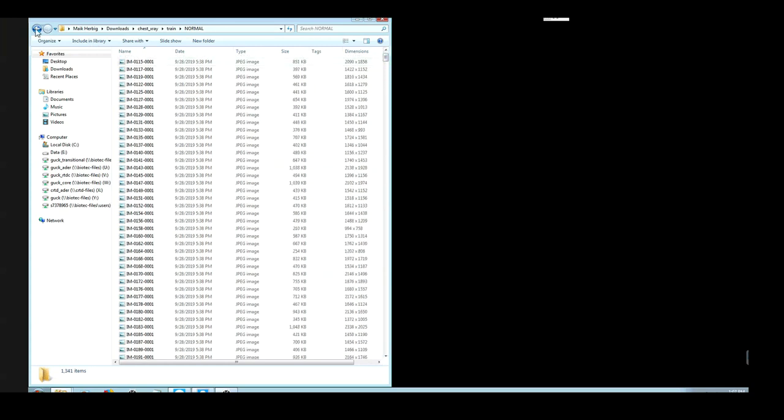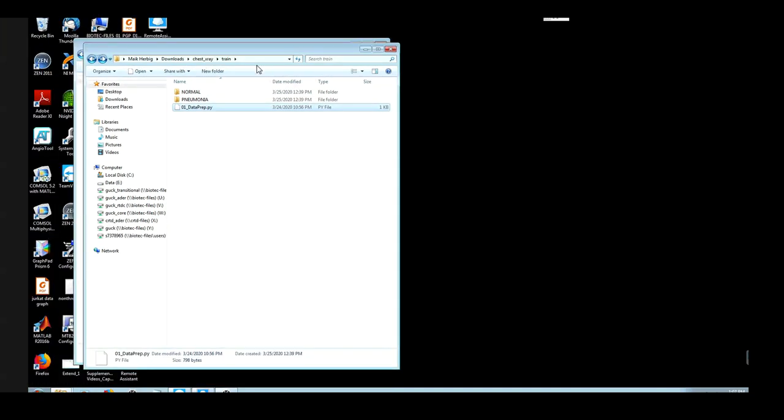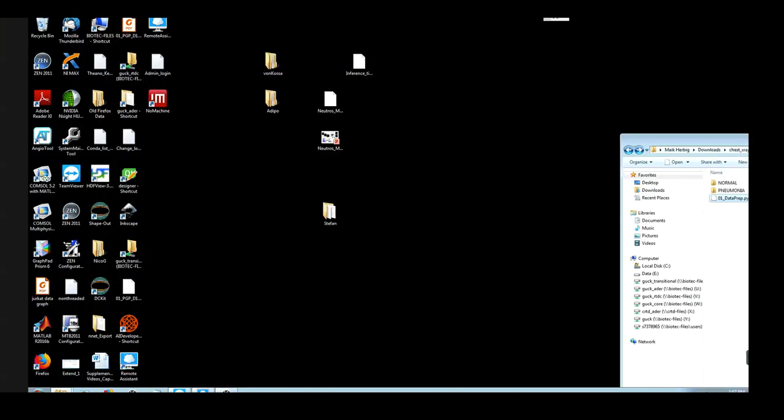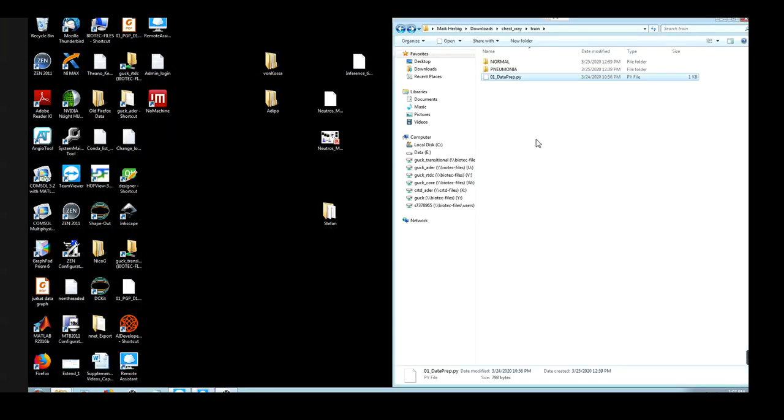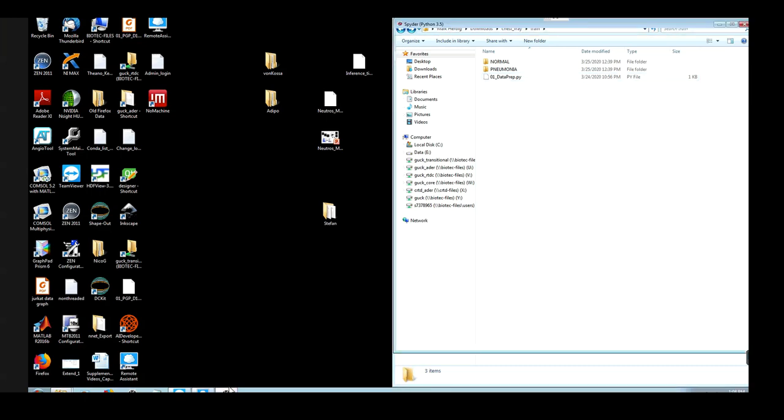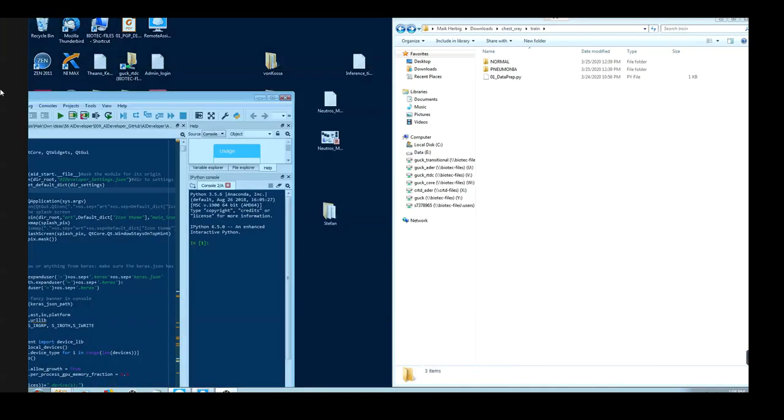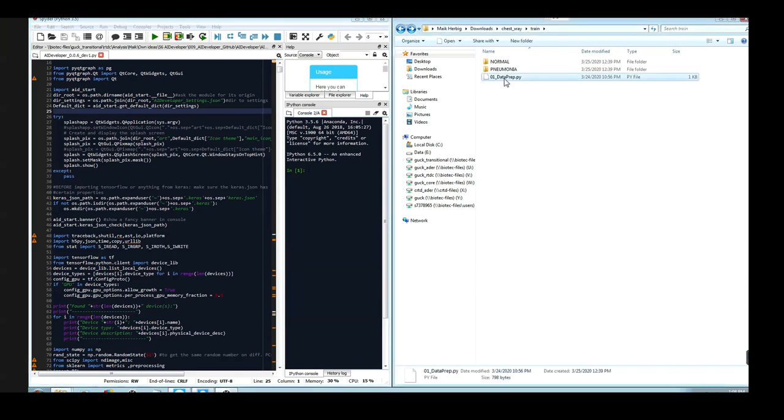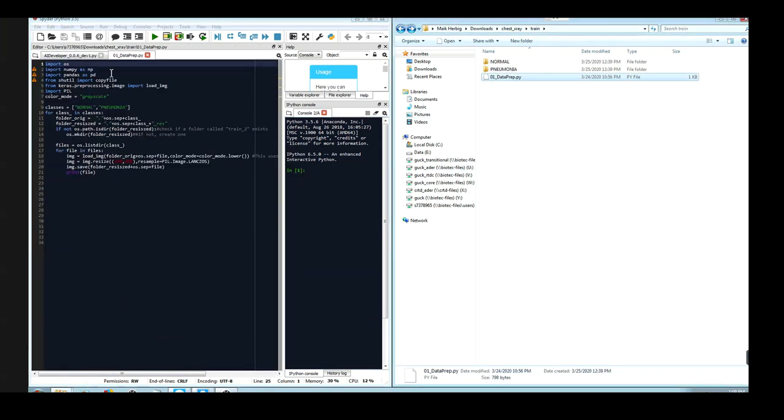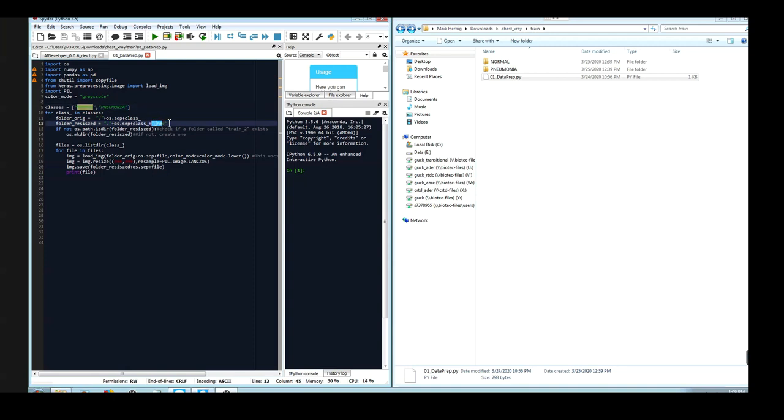For this task I wrote a Python script. This Python script you can actually execute using AI developer, but as I will also need the computing power from my graphics card, I will run AI developer from script. Therefore I will now also execute this Python script using Spyder.